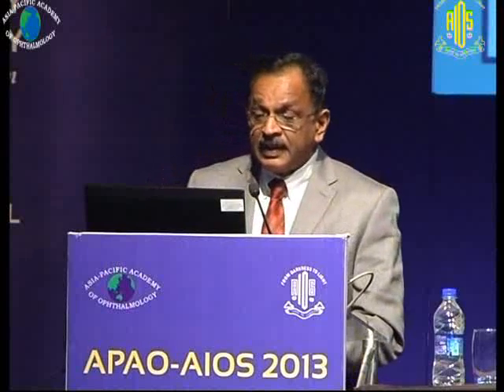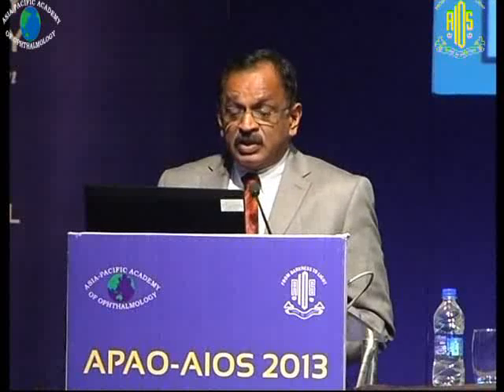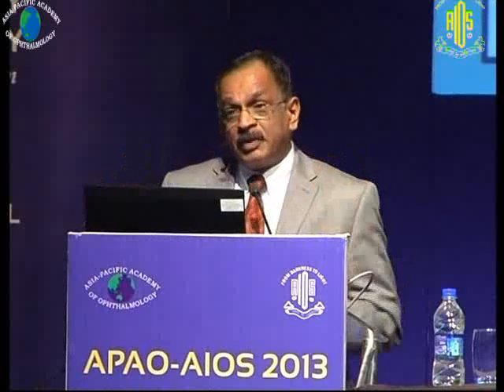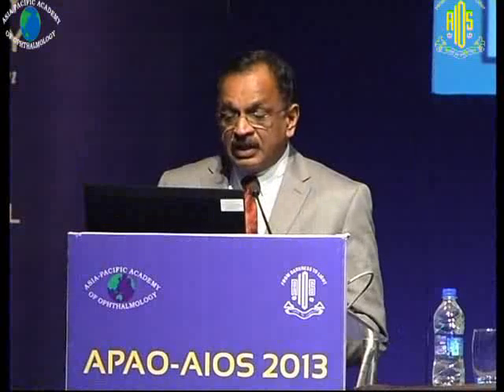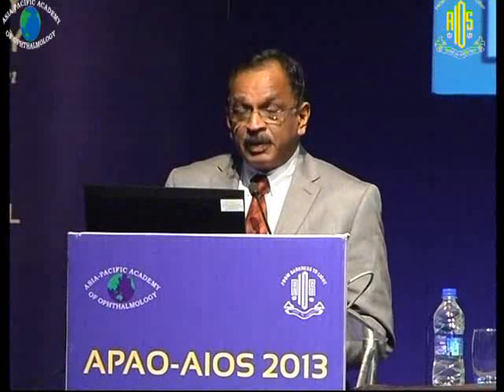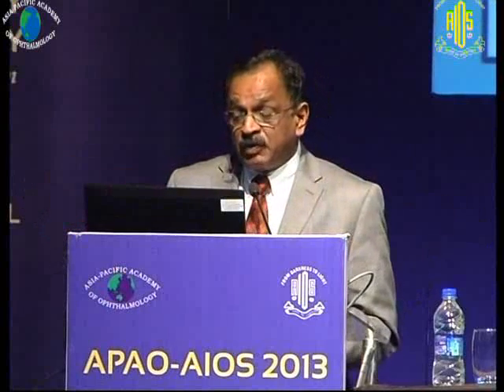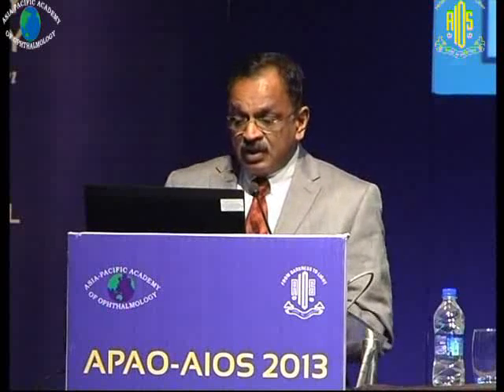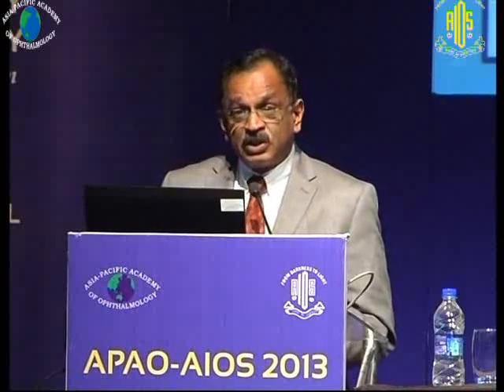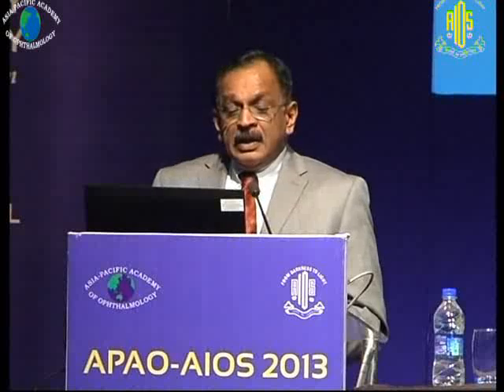to have a better apposition of this retina on the back of the eye. When you have an anterior PVR, you should make sure that you remove all the posterior membranes before you take care of the anterior membranes, because you flatten the retina, and then you would take care of the anterior PVR. But in certain cases where there is a central displacement of the anterior PVR, as was shown in this animation, you need to relieve the traction first to have access to the posterior part of the retina.